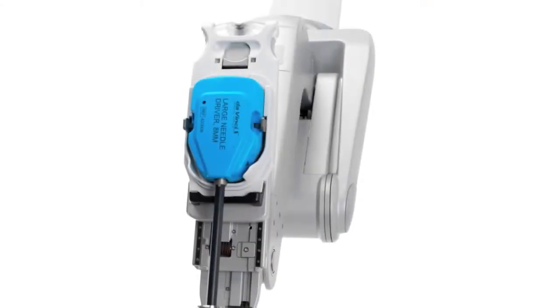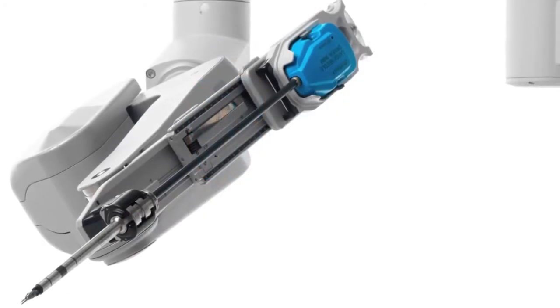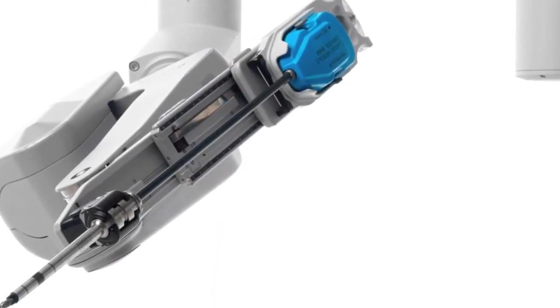And so most patients are really happy to be able to have the robot to have those smaller incisions and a quicker recovery. All the pain that the patient experiences is from the access points through the abdominal wall. And these are fairly small incisions, 8 millimeters to 12 millimeters, that allow us access ports for the camera and the different robotic arms, which truly gives the surgeon 3D vision.